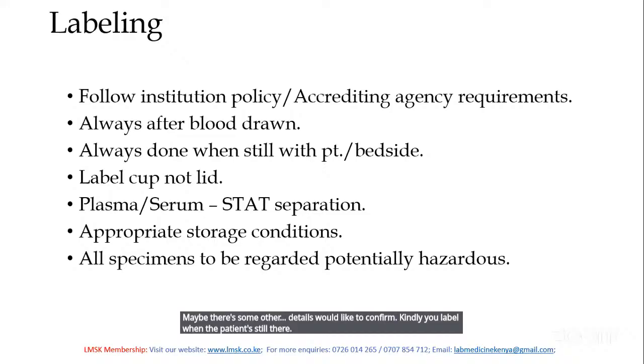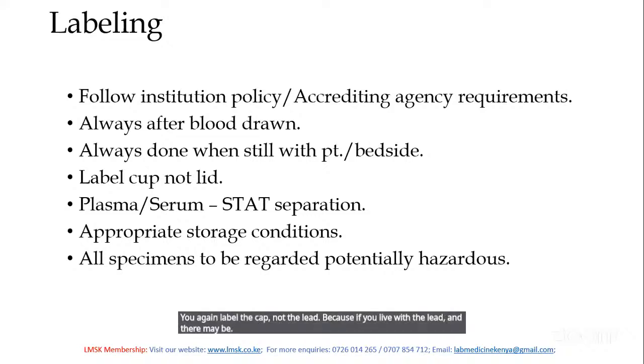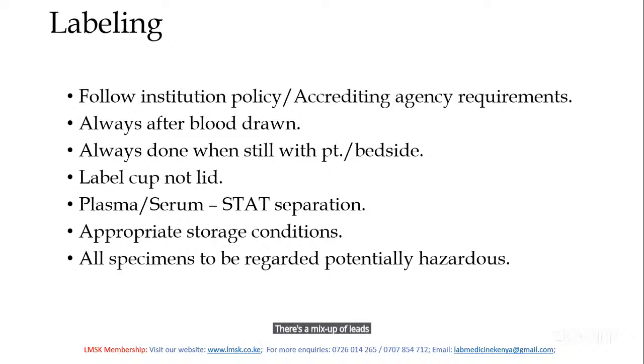You again label the cup, not the lid. Because if you label the lid and maybe there's a mix-up of lids on the table, you may not know which one is for what. So you label the cup or the tube, not the lid. Then you separate the cells from the blood fluid immediately. Get your serum or plasma. Apply appropriate storage conditions, and all specimens are to be regarded as potentially hazardous.